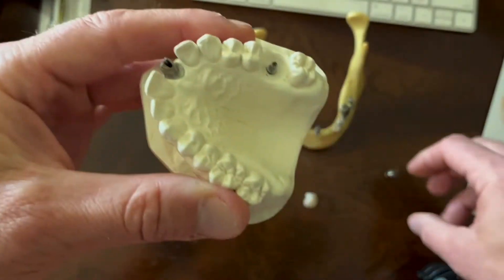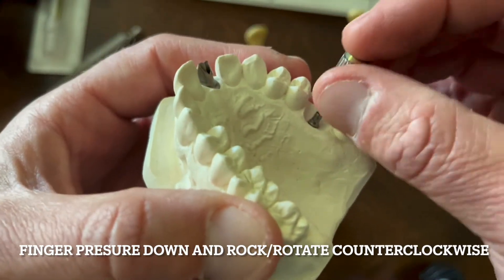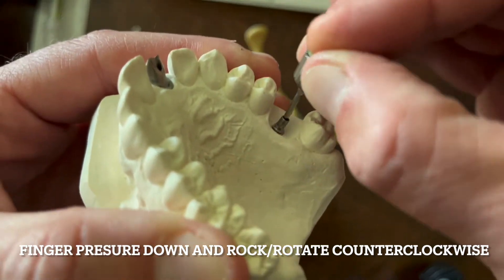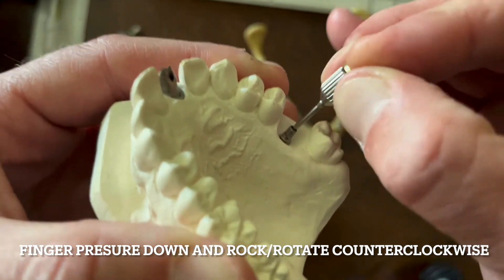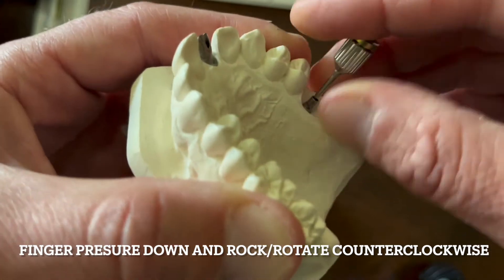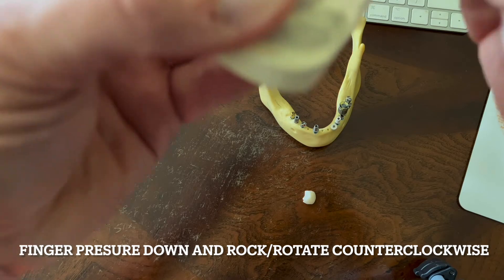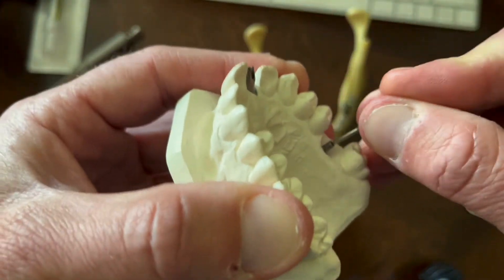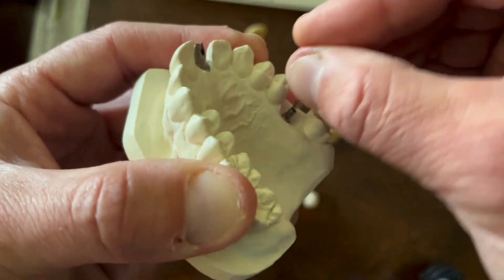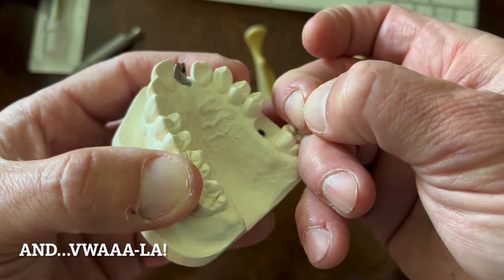Let me show you something very simple — thank you, John Lewengrath, for showing this to me the other day. If I'm backed all the way up and go counterclockwise and simply rock, I heard it. If I just keep rocking the abutment, then I should be able to pull right up and get it out. I'm rotating counterclockwise, and out comes the abutment right away. Cool.